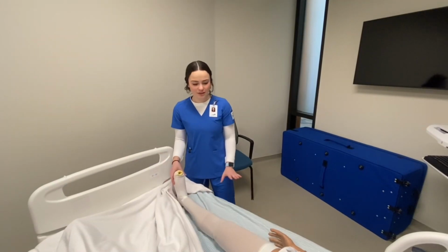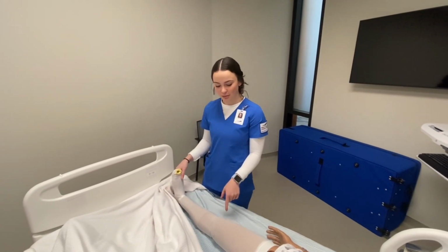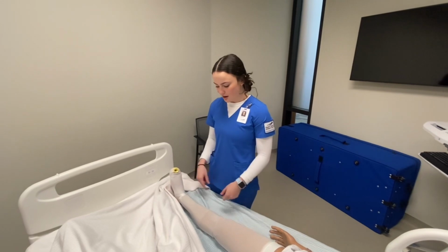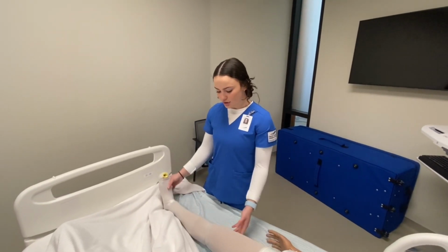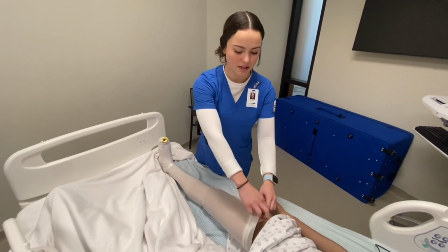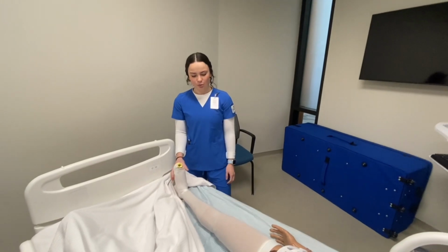Okay, so one of the big reasons you want to make sure there are no wrinkles is because it can cause skin breakdown and it can cut up their skin. It can also be really uncomfortable for the patient themselves. And when you're getting wrinkles out, ideally you want to go from underneath the actual TED hose. And you want to do that as you're working up and putting the TED hose on completely. There's also a few different types of TED hose. So there's some that end right around their knee. This one goes all the way up, so you can see that there's a little grippy section that holds it all the way up to their thigh. So that's another thing that you want to make sure when you're picking out the correct size.